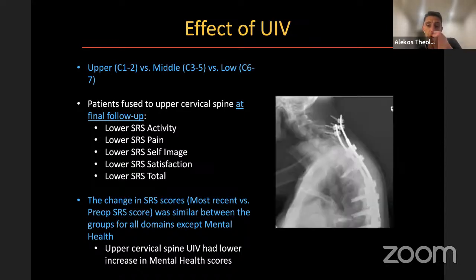But we do also need to take into consideration that mid-cervical fixation, especially with subaxial lateral mass screws, may not be ideal, and it may set you up for another proximal junctional problem, as seen on the right. So some may argue, I'm not advocating for it, but you could say, well, in these types of cases, consider cervical pedicle screws, or going up to the C2, taking these data into account.